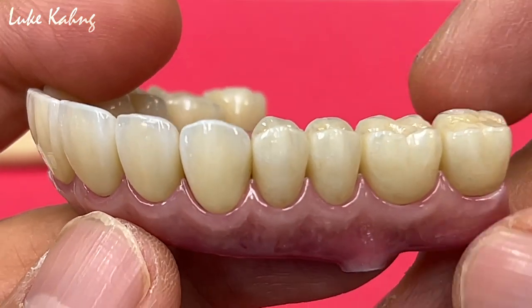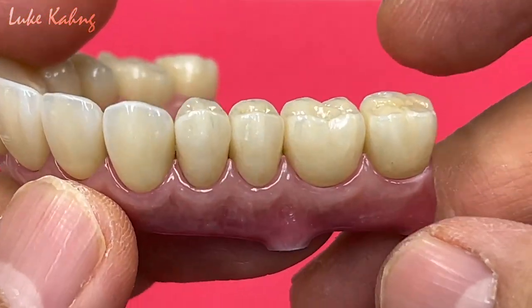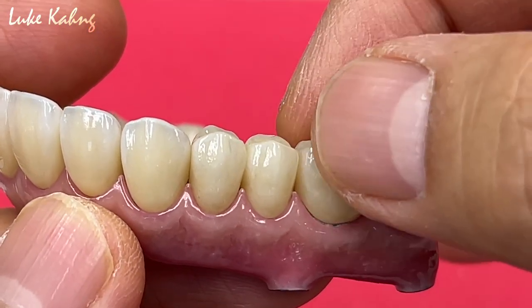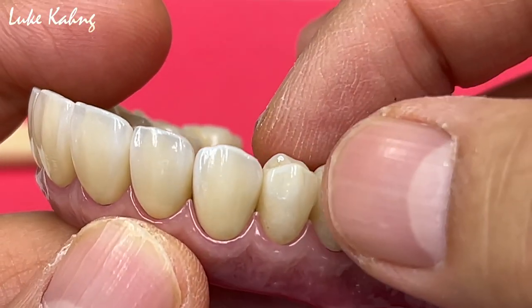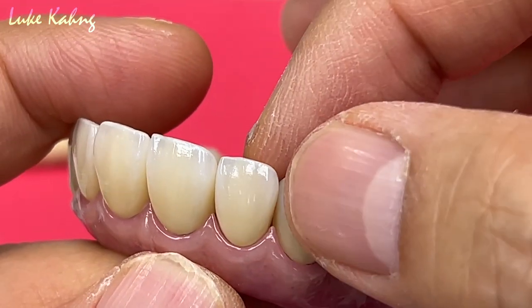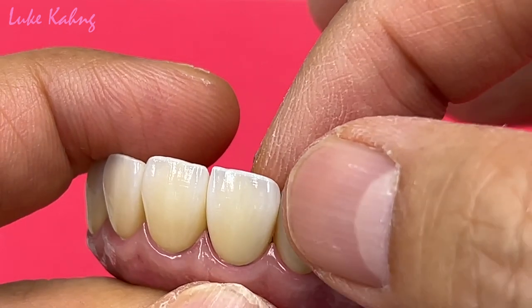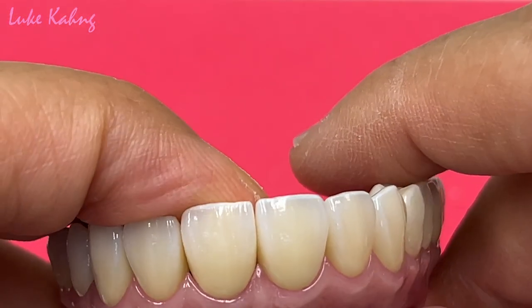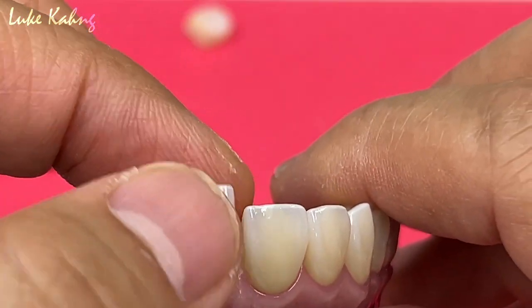Before we go to the final cementation, as you can see, there is no space, so we can easily cover with the cementation. Therefore, I don't have to use any composite in between the teeth, which is a high technique. It's very sensitive.